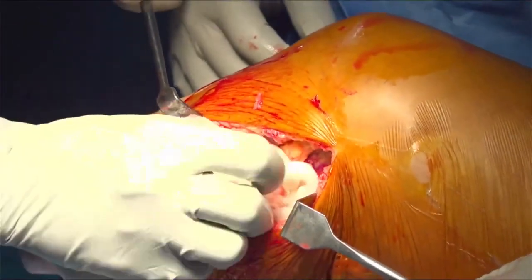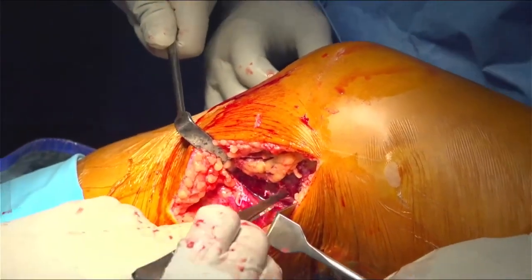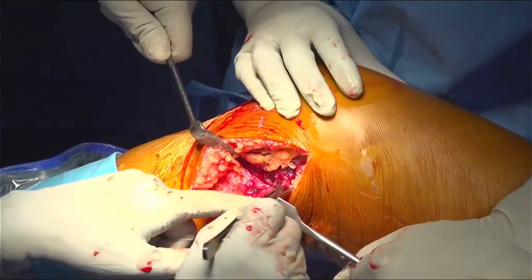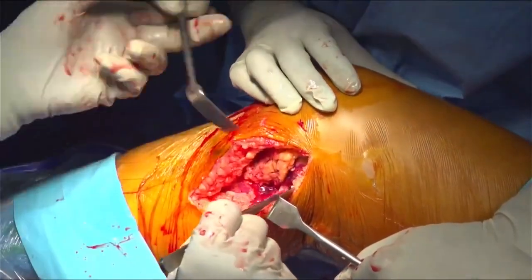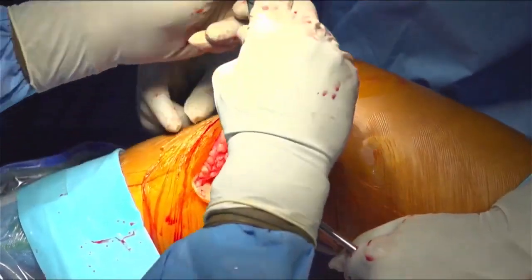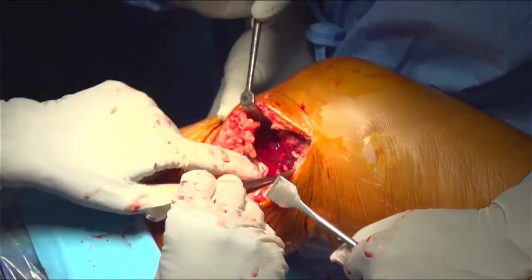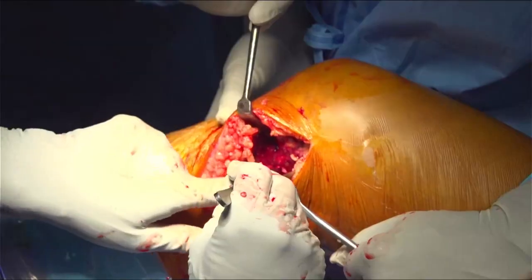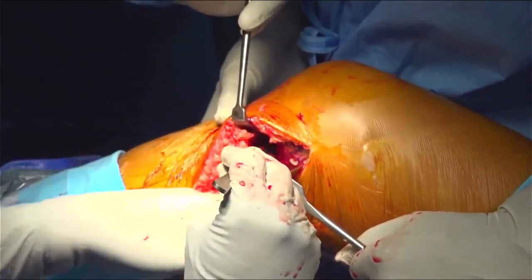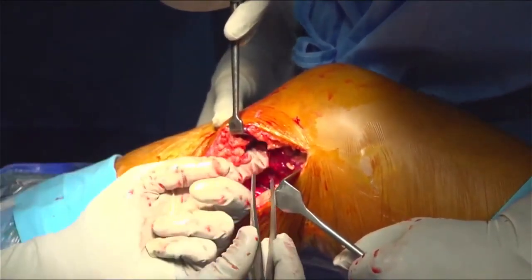Forceps please. Non-tooth forceps please. Okay, so this is one layer of the inner sheath. This is another layer of the inner sheath.